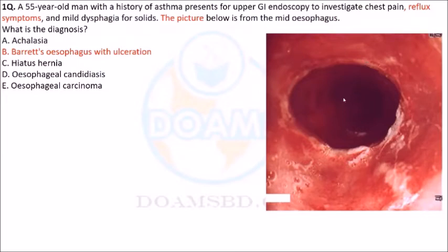It may be a little more, no problem. Color doesn't mean that it will fit as it is what we are describing. Looks like, sir, hyperemia. No problem. Yeah, hyperemia, this is a metaplastic epithelium. There is no other explanation. You just compare with the inner epithelium of the stomach. It is a darker area, so it is not that bright. So the color is the same, stomach and the esophagus. This is the main issue.